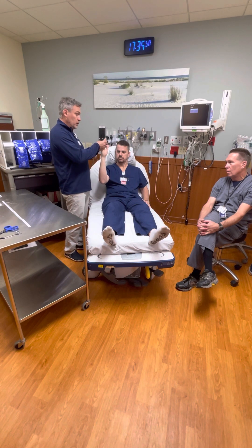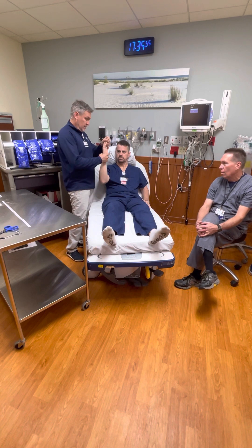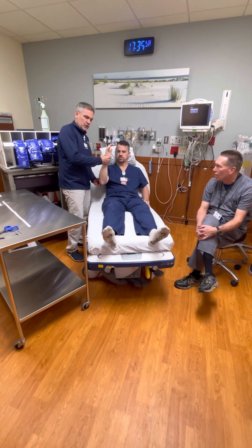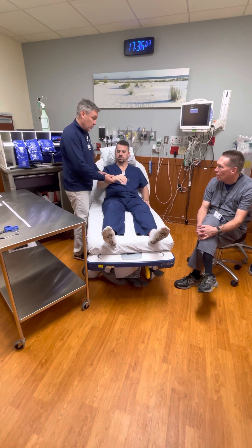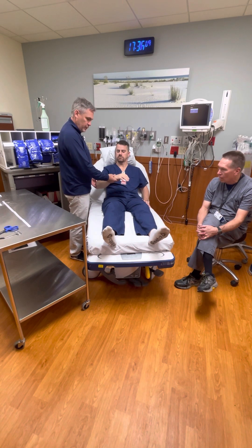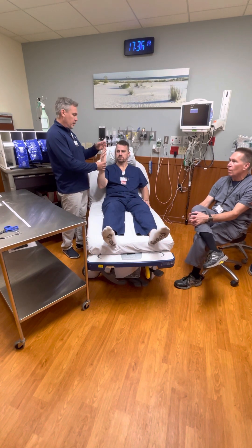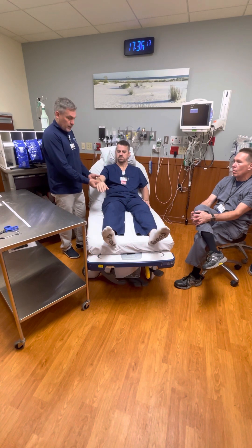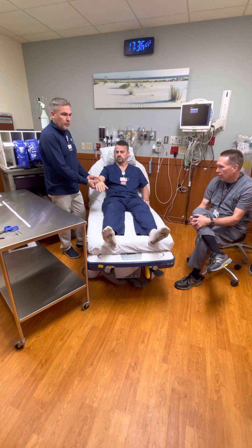You could have a partner hold the fingers out of the way. Sometimes you can't do that - sometimes you're going to have to hold it and then wrap and pull your fingers out, which can be very difficult. Unfortunately, sometimes the patient is wiggling around and won't hold still for various reasons. This is not always the perfect scenario of a patient just sitting there letting you manipulate their extremity as you wish. We're going to go through the ideal situation where the patient is cooperative, but keep in mind it's not always this easy.